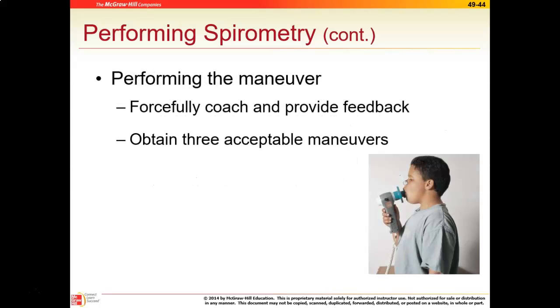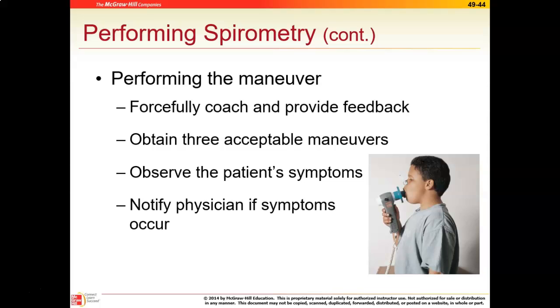Okay. So when you're actually going through the maneuver itself, you're going to have to do real vocal coaching with them and provide feedback. Because it's very difficult to blow out when you're taking this deep breath in and exhaling fully. In order to get all the air out, you have to do this maneuver for about 6 seconds. And so trying to get people to go that entire 6 seconds, especially when they're elderly or they have respiratory issues, can be very difficult.